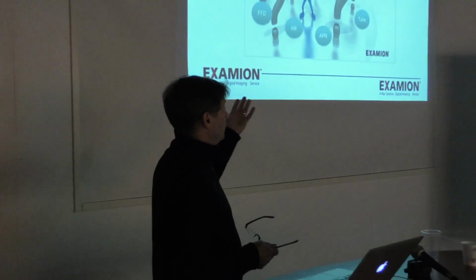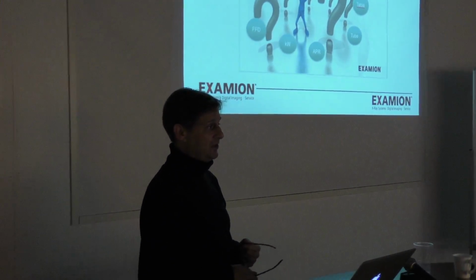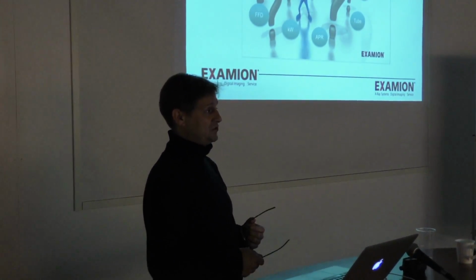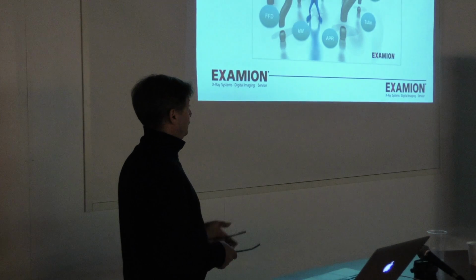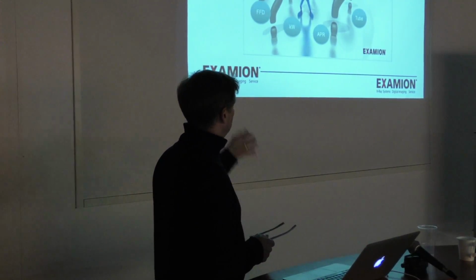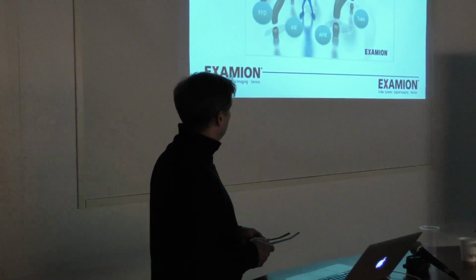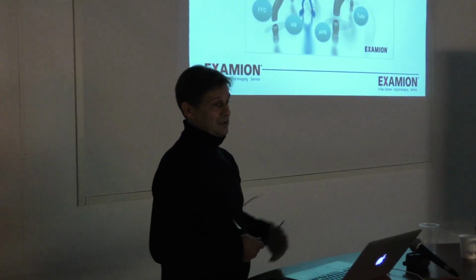So here you see the question mark is always like once you get a brochure in your hand, for example, or you see a machine, you ask, what does the machine do for me? Well, just putting a few of the parameters, and it's endless to be honest. People are talking about the power in kilovolt, milliamps, mAs. We all know about that. You also see the kilowatt. What is kilowatt?